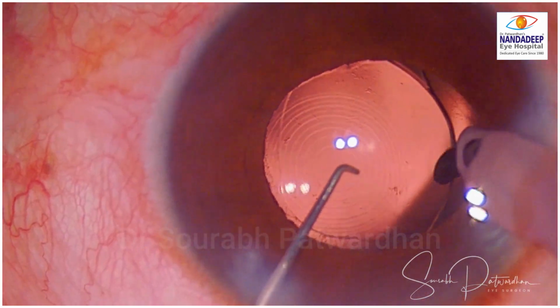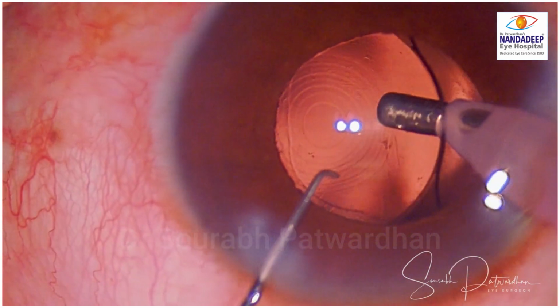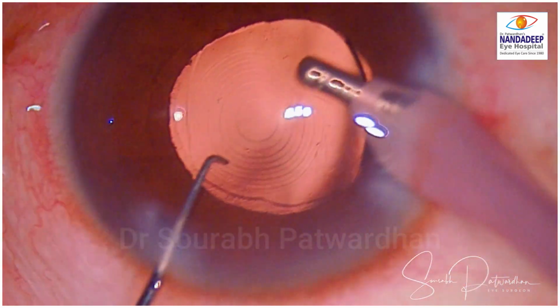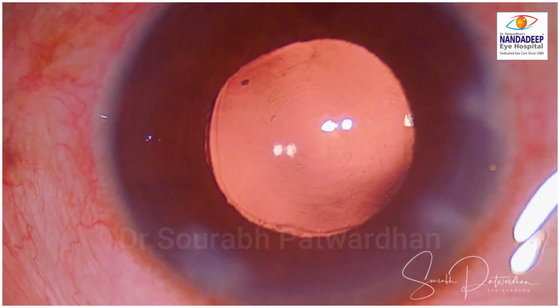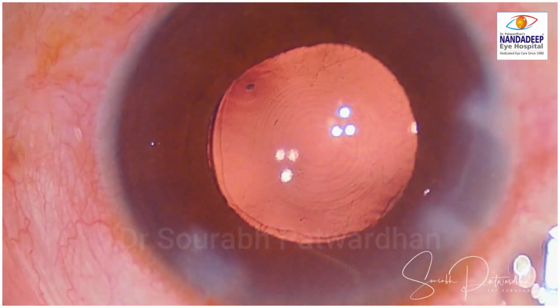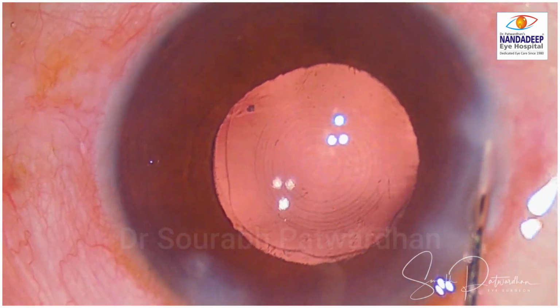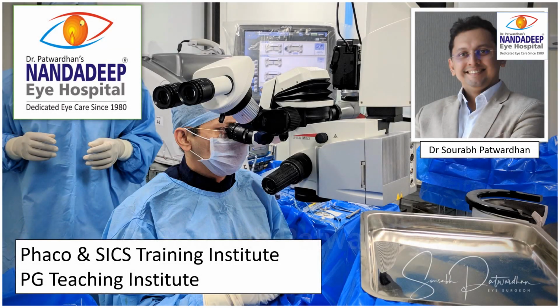So whenever in doubt at the end of the surgery, if the pupil has come down, you can use even the iris retractors, or like here you can use the Y pusher as well, and make sure that the IOL is right in the bag before you close the case. That's the take home message from this case. So you don't need to take the patient back to the table to again dial the IOL in the bag.